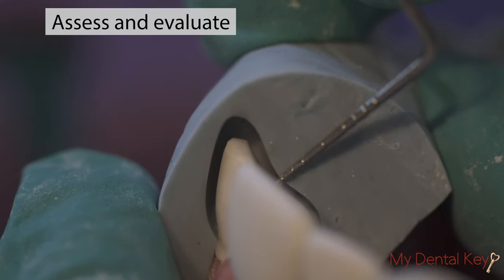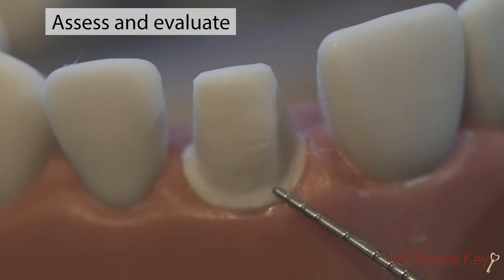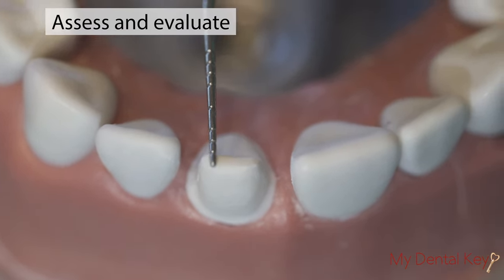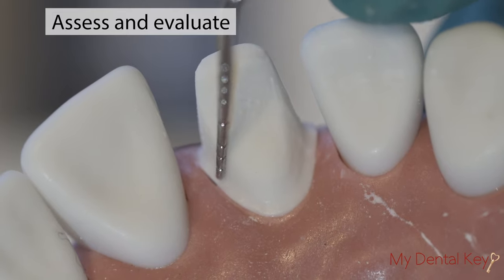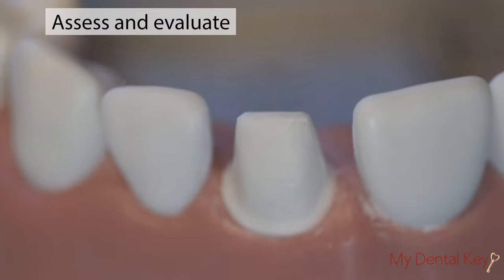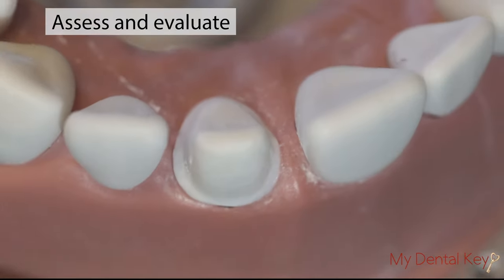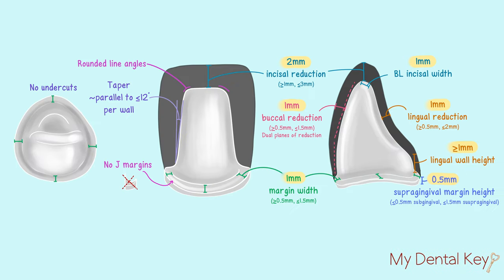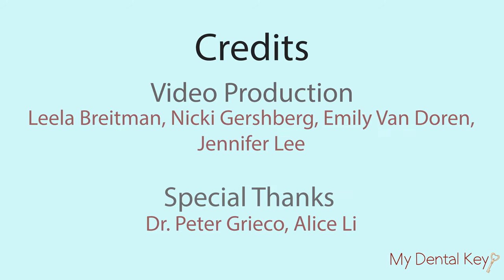Evaluate the crown preparation using our checklist. Ensure that there are no undercuts, that there are no J margins, that all line angles are rounded, that there's a chamfer margin or the appropriate margin expected by your school, and a concave cingulum. That's it. You completed your crown preparation for tooth number 9, all ceramic crown. Congratulations, and thank you for learning with us today.